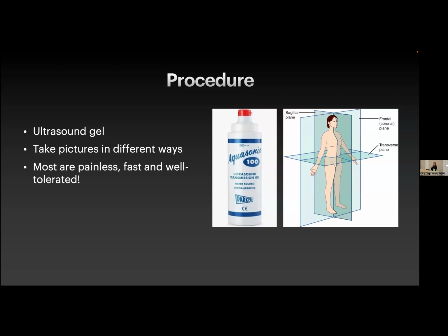And really, most of these studies are painless, they're fast, they're well tolerated. You may feel a little bit of pressure, but the great thing is, because the ultrasound tech is there scanning with you, you can talk through it and say, hey, that hurts a little bit. Can we get a little less pressure here? Or I can handle that, it seems fine. And so there's a lot more interaction during the examination.